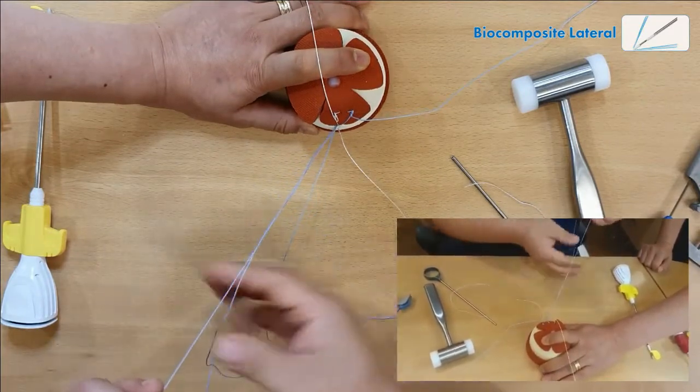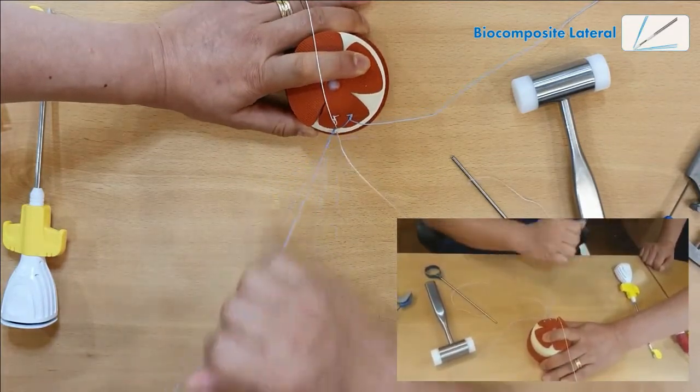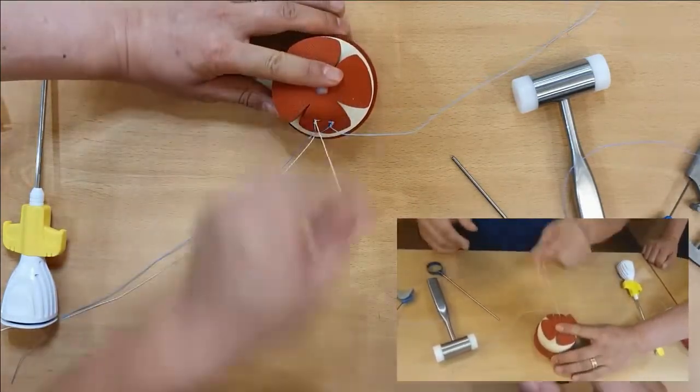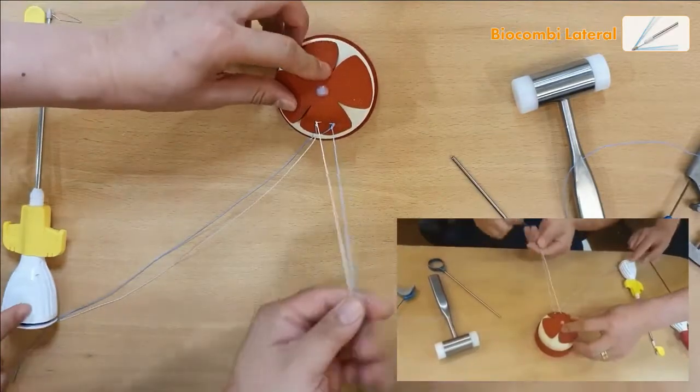I'm going to remove the fiber wire from the lateral anchor. I can cut this. I'm just going to show you the other half.